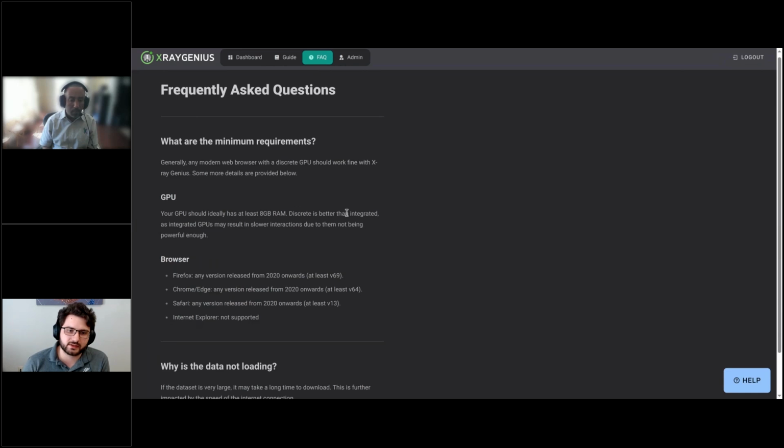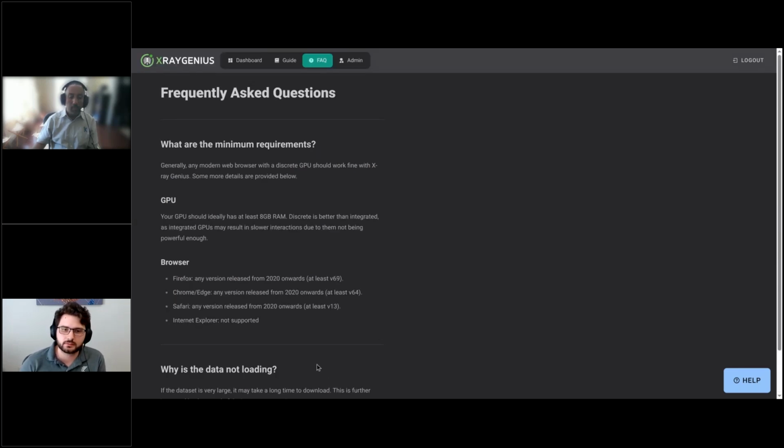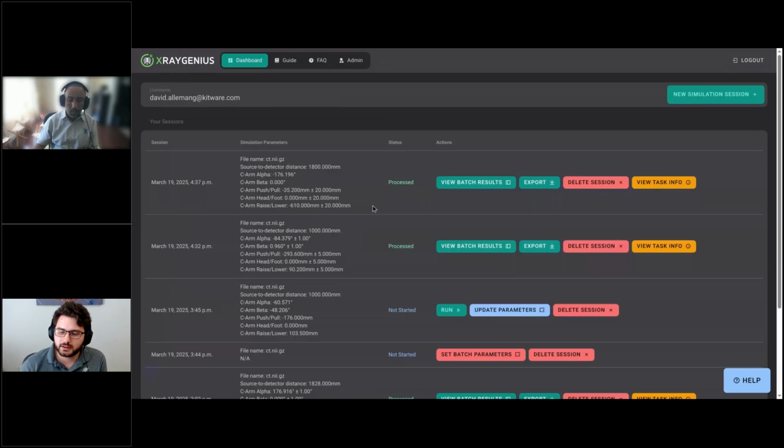You are doing some rendering in the browser. So here we have some listed minimum requirements. You can get away with less than this, but it might not be as interactive or responsive if more is going on. The short version is, Chrome and a dedicated GPU of some kind will get you there. You can get by without it, but all of the hard work happens in the back end. All right. Thank you. Yeah, thank you.